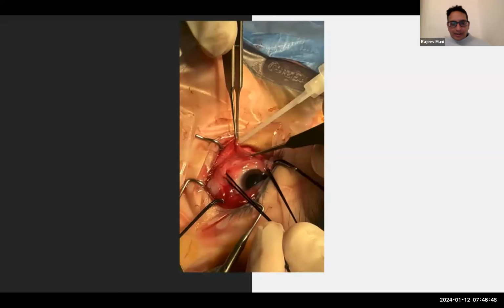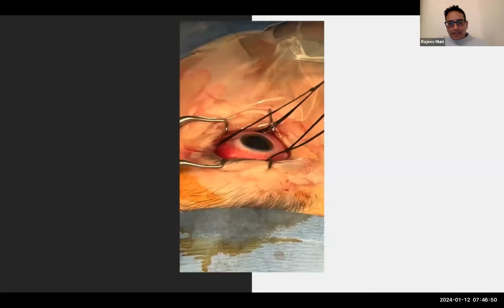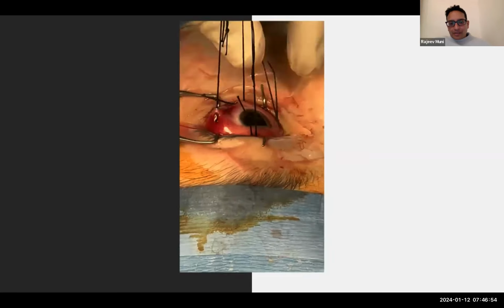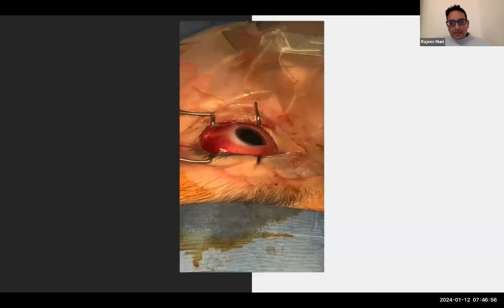Sometimes we're fairly rough and torquing the eye quite a lot, draining, cryo. It is a pretty invasive procedure from that perspective. And so this was an attempt to circumvent a lot of the tissue dissection. And I thought that in a 15-year-old, not opening the conjunctiva or doing any of that and getting an encircling band around would avoid a lifetime of potential issues.